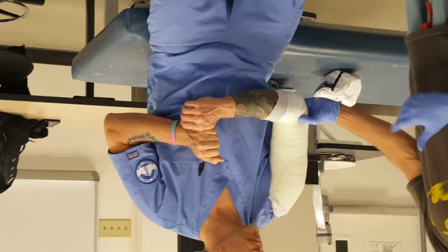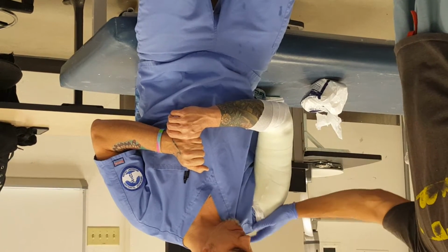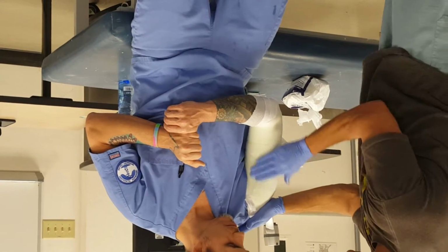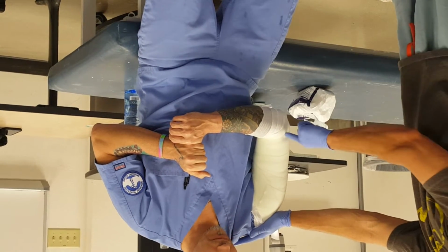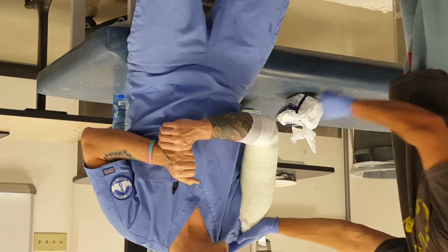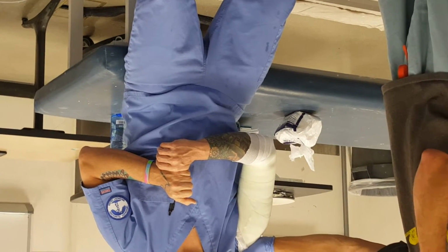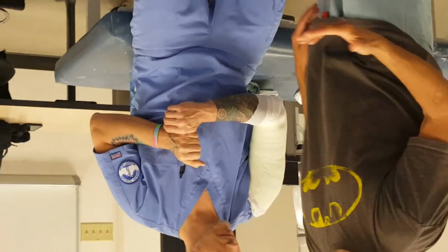Be sure before you cut it that it's nice and dry, because it is so thin that it'll break or crease. So just take your time. It takes 3 minutes to dry or get hard. Be a little bit longer than that. Take your time. When you cut this out, the number one thing people do is they cut their mold out because they're used to a Munster. Oh, we'll just cut right up here. No, you're cutting the opposite side. They got to be able to bend their hand up or their arm up too. So again, I'll draw, they only have to be able to get to 90.